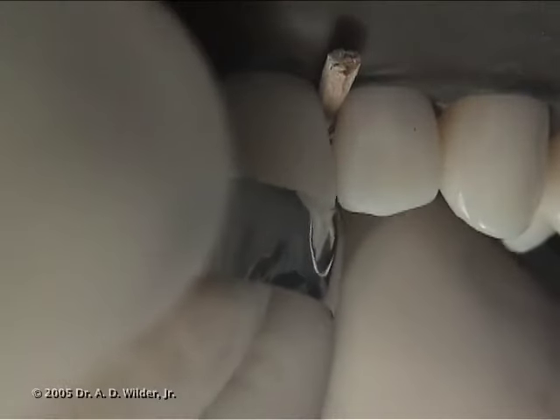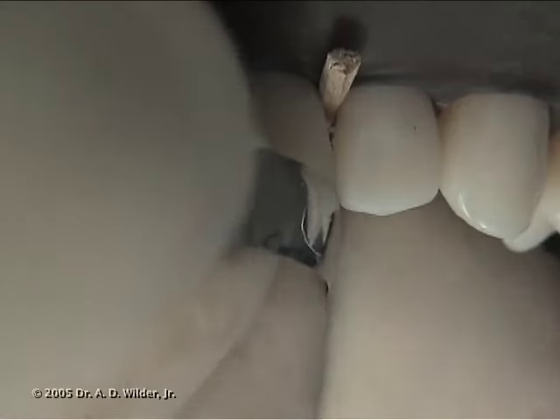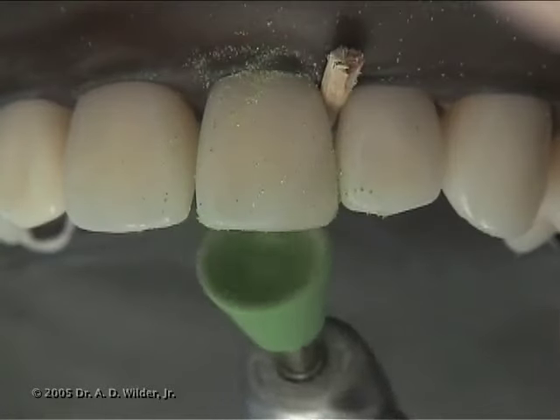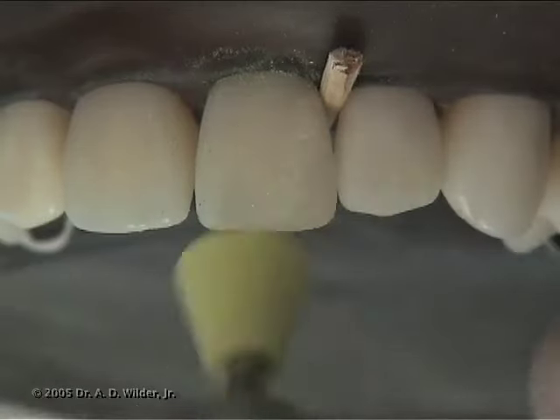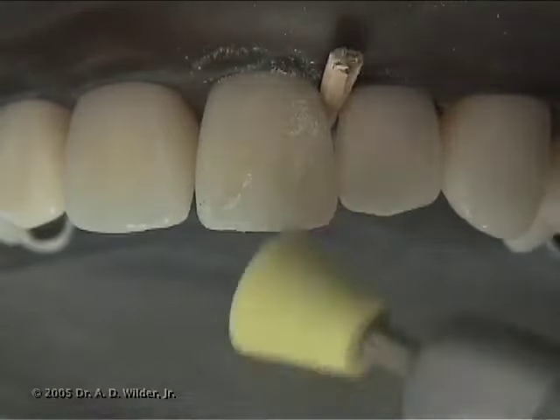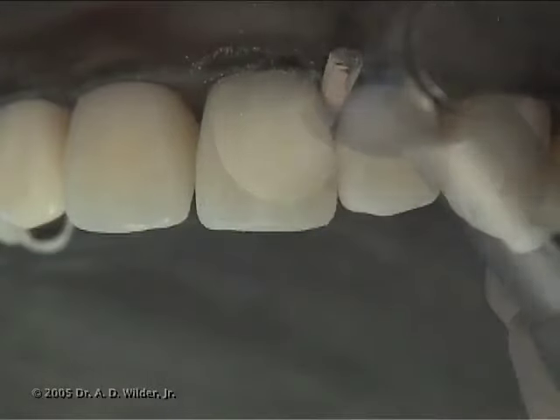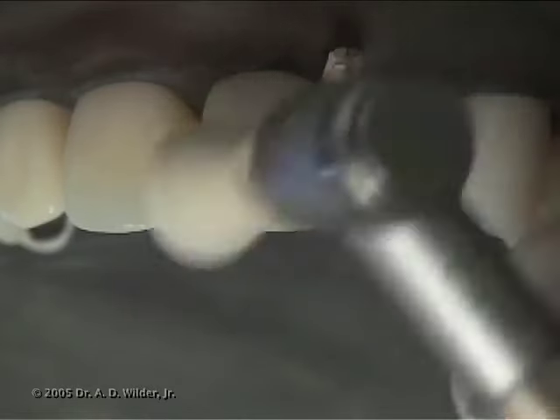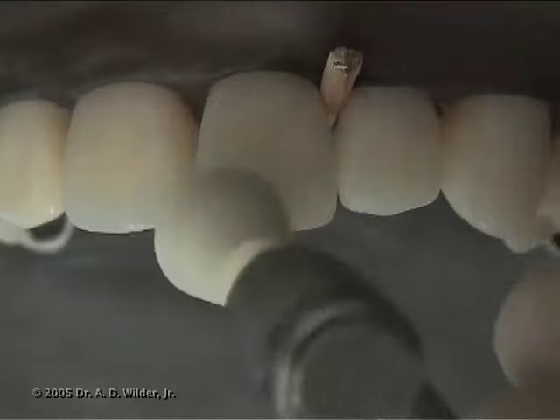With a wedge in place, you can also use a Talfelmeyer matrix band to adjust the incisal embrasure. Finally, you can finish and polish the restoration with a silicone-impregnated rubber polishing cup. Green, then yellow, and then white is the typical coarse-to-fine Jiffy polishing system.